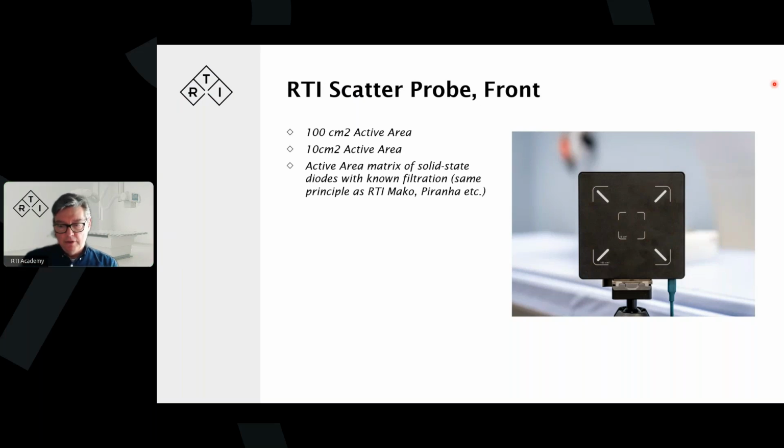And if we have several of them, we can work out not only the energy dependent dose reading, we can also work backwards through the total filtration and HVL tables and figure out what the kV, the energy, is that we're looking at.